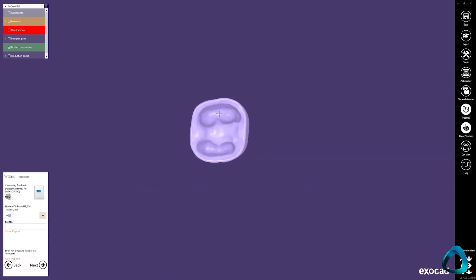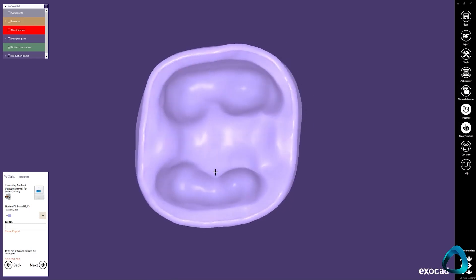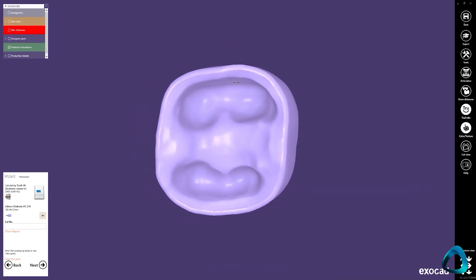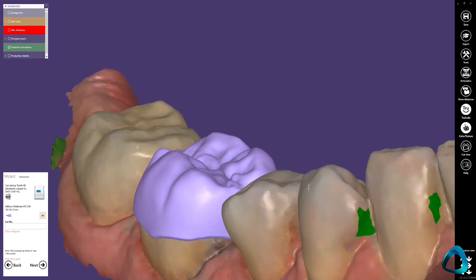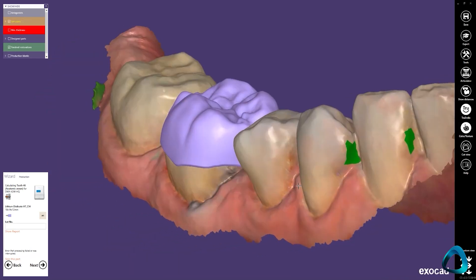Once you get comfortable with this CAD designing process, this shouldn't take you longer than 15 to 20 minutes. If you factor in milling and glazing, you should be able to completely manufacture a crown in-house within one hour with a bit of training.